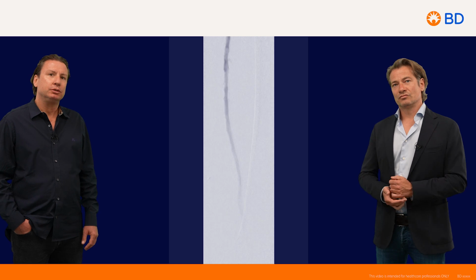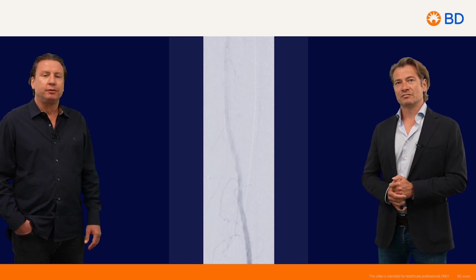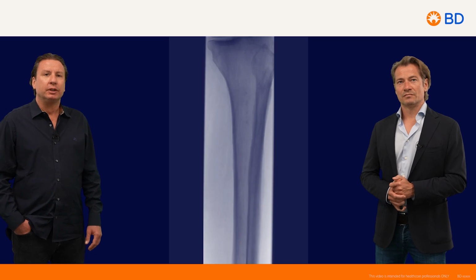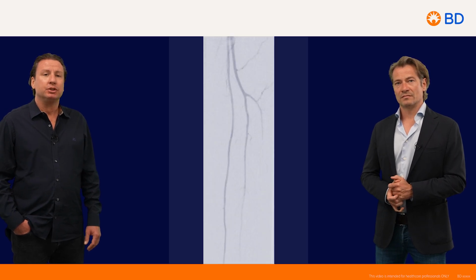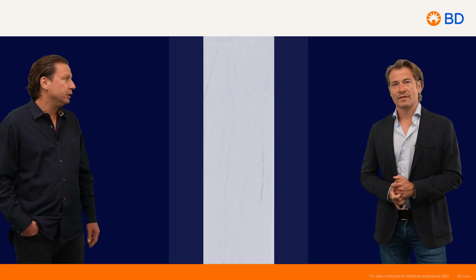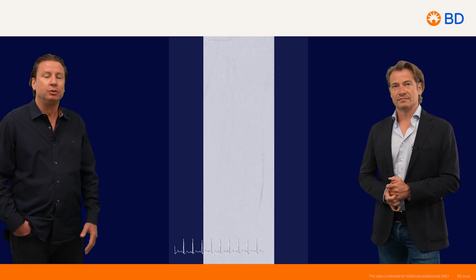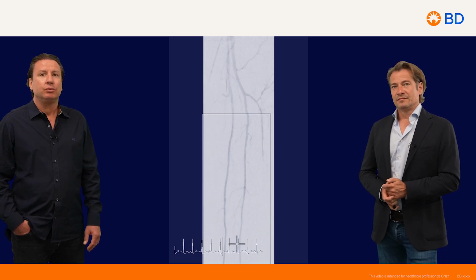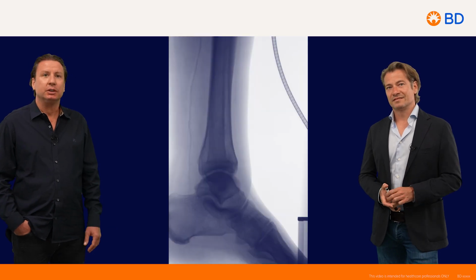That's the final result, which is very good. Very brisk flow now. This is an unselective angiography. You must imagine that the sheath is in the iliacs. But considering this, it's a very good, very fast flow down to the foot. Again, also here, no distal embolization.